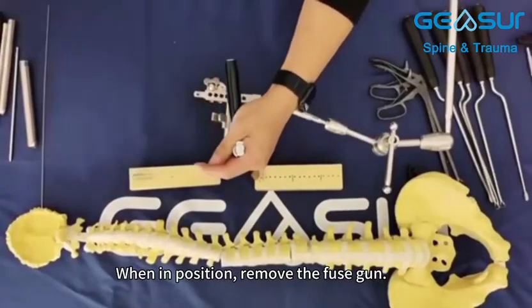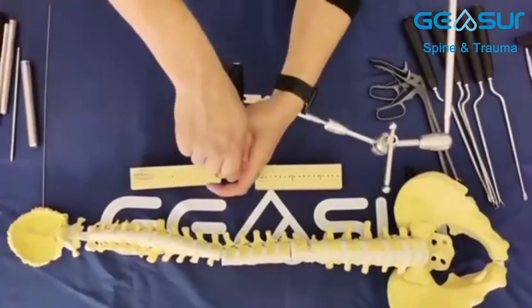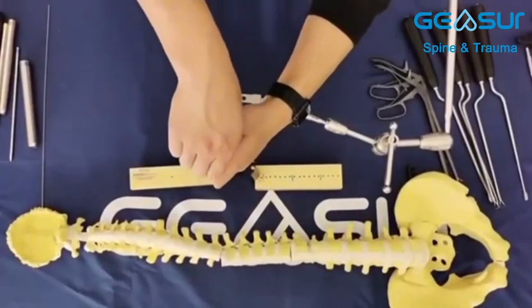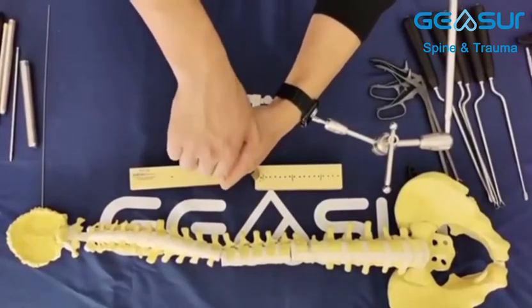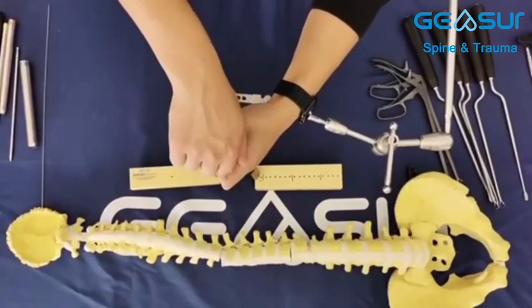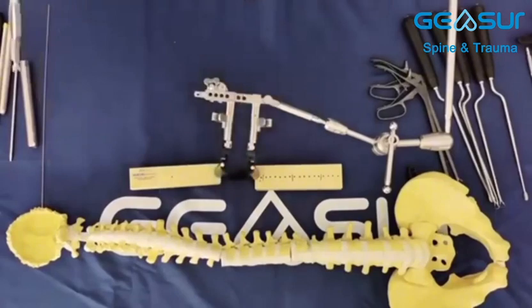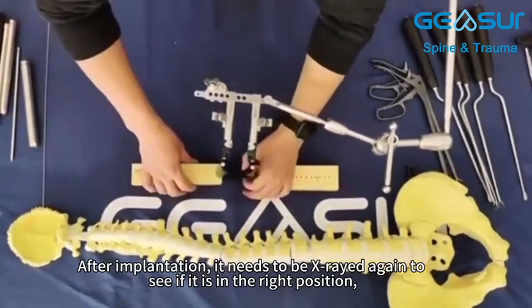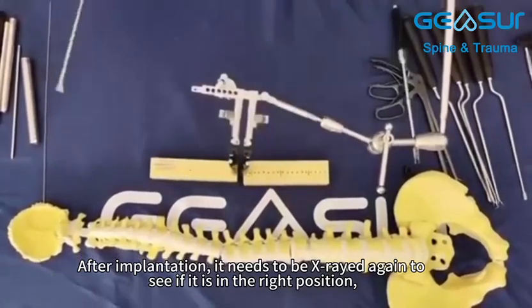When in position, remove the fuse gun. After implantation, it needs to be x-rayed again to see if it is in the right position.